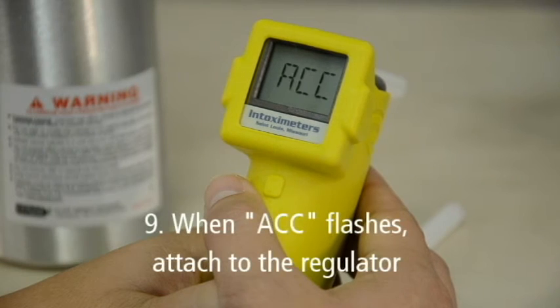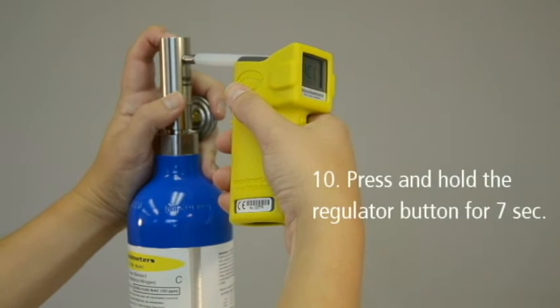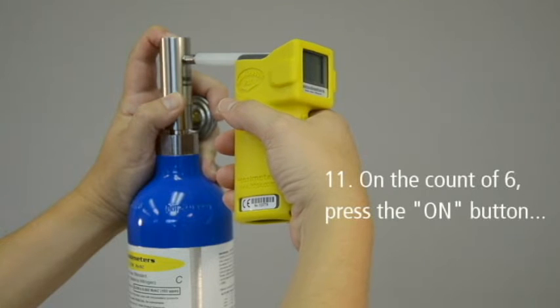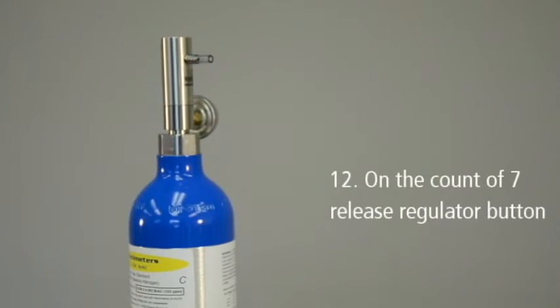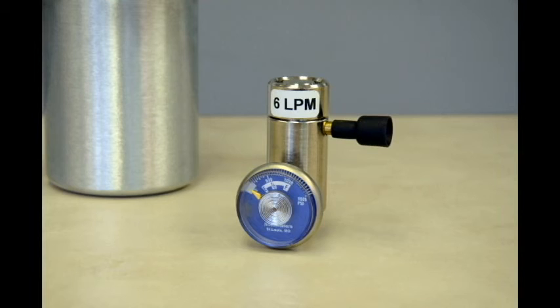When the FST screen flashes ACC, attach the FST mouthpiece to the tank regulator. Next, press and hold the regulator button and count to 7. When you reach the count of 6, press and release the FST's ON button to take the gas sample. On the count of 7, release the regulator button. Gas must be flowing through the mouthpiece when the ON button is depressed. If you are using a 6L per minute regulator, the Alkosensor FST will automatically sample the gas and you will not need to press the ON button.